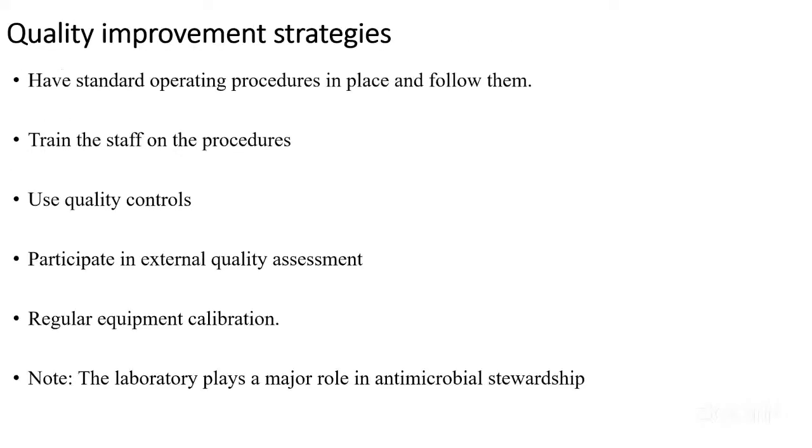So we have some quality improvement strategies that I have outlined. Most important, we should have a standard operating procedure in place. These standard operating procedures should cover the pre-analytical phase, how we should collect the urine and communicate how to collect the urine from these patients, all through to the post-analytical phase, how we report and how the doctor should receive. We should have standard operating procedures for each phase of the processing.